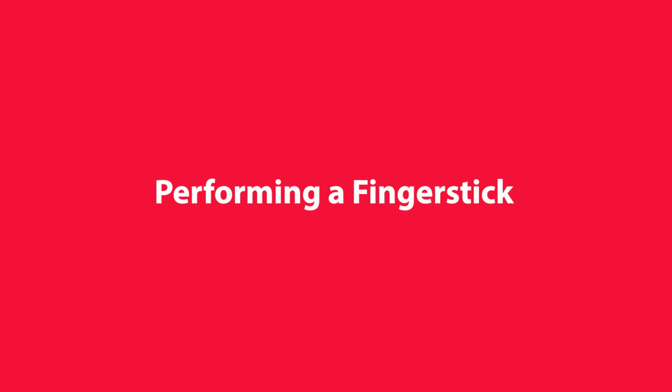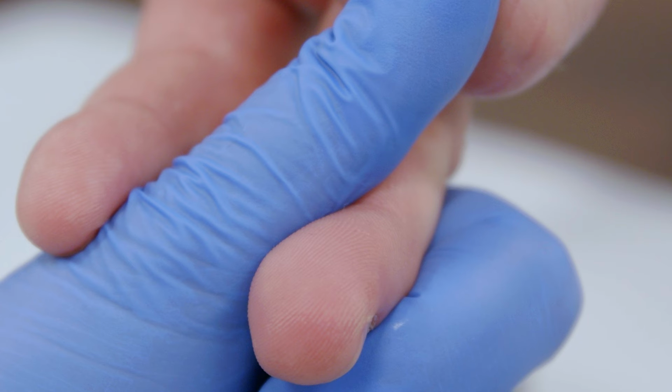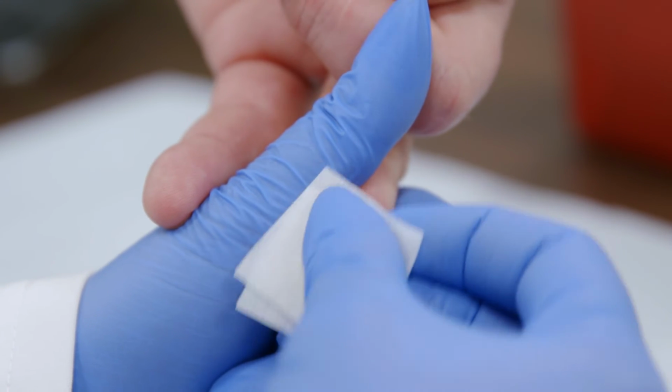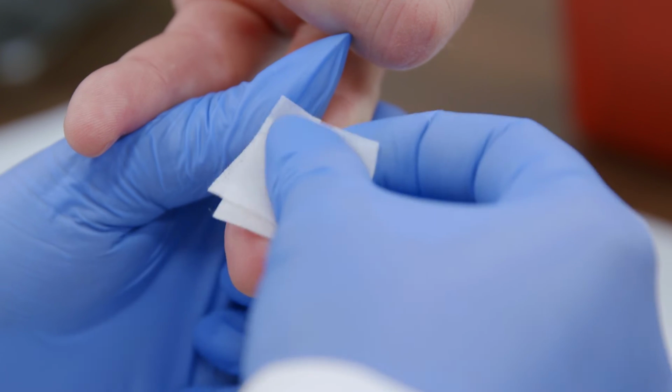Now, perform a fingerstick on the patient and collect a sample. Decide whether you will collect the sample from the middle finger or ring finger. You can ask the patient which they'd prefer. Clean the finger with an alcohol wipe. Make sure the finger is dry before proceeding.